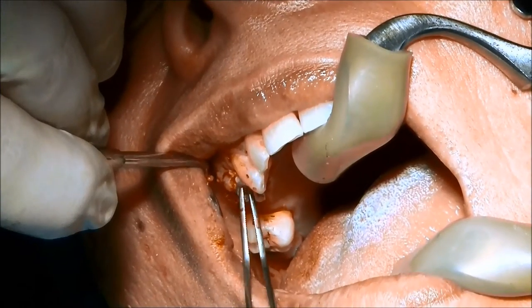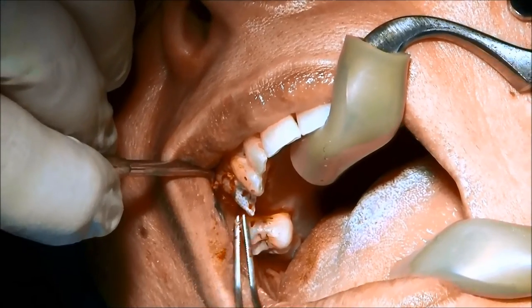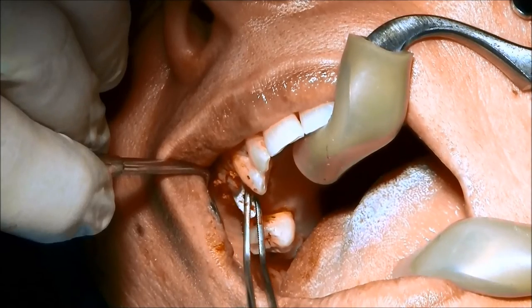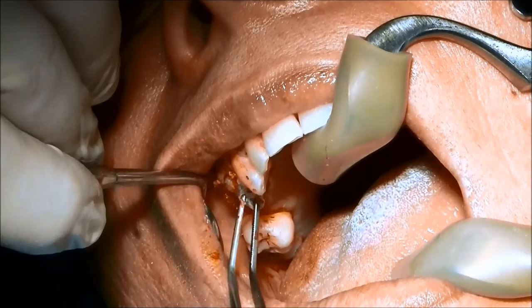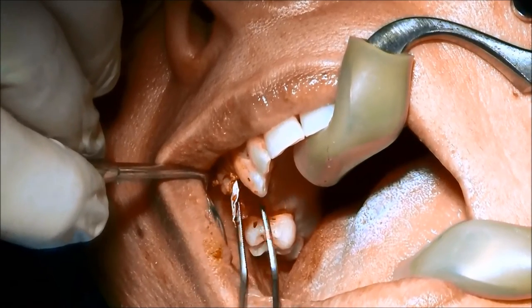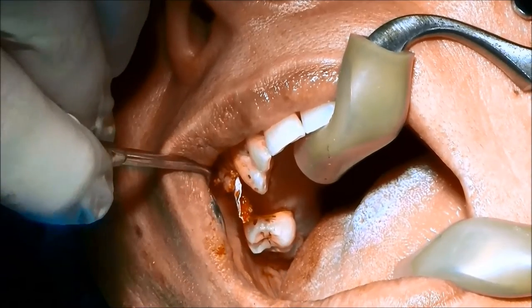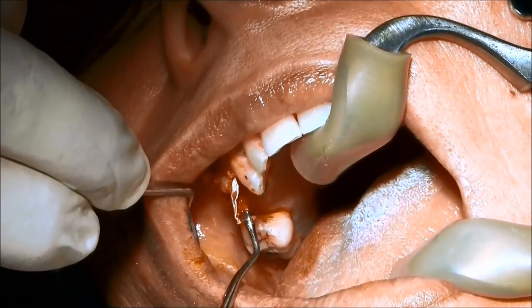We're drying the surface and keeping the bone contained. Now I'm just going to gently look for that membrane and we're going to pull it down a little bit to cover the top of the implant. There we go — you can see the membrane now.